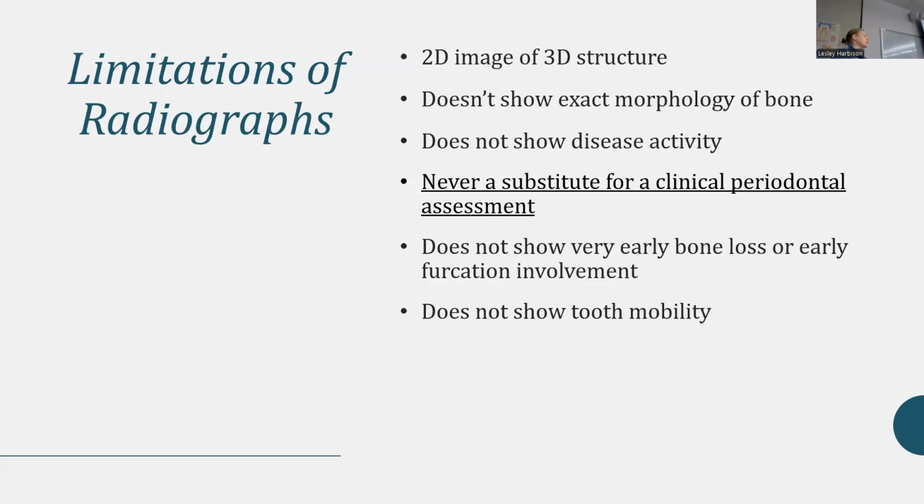I've said this like a million times in this class, but we're taking a 3D object and we're making it a 2D image. So all of the depth of the whole skull is compressed into a flat image. That's why we're layering landmarks, we're layering anatomy, we're layering teeth cusps, your buccal cusp over your lingual cusp. We're just layering everything.